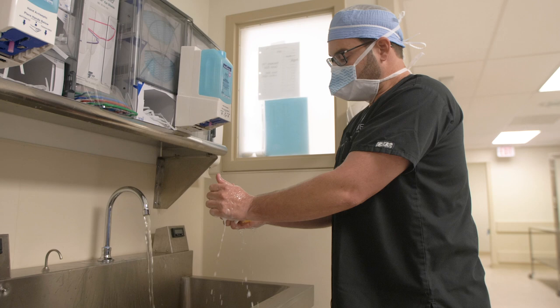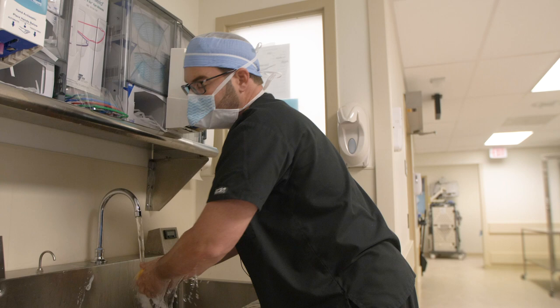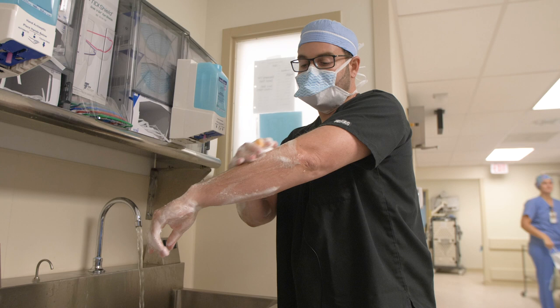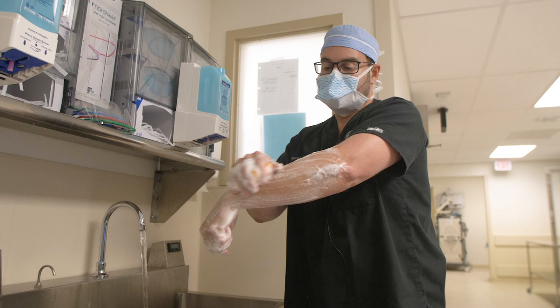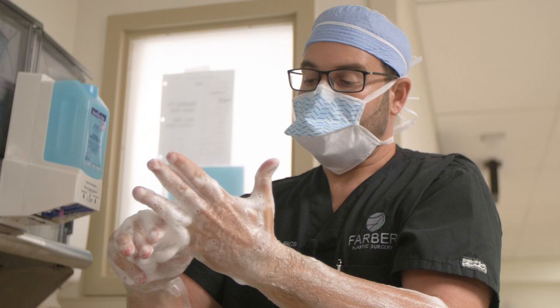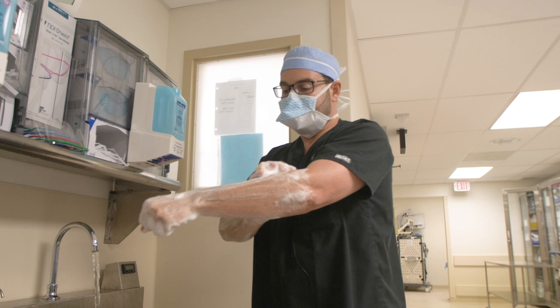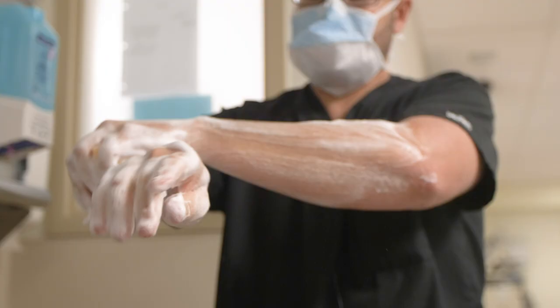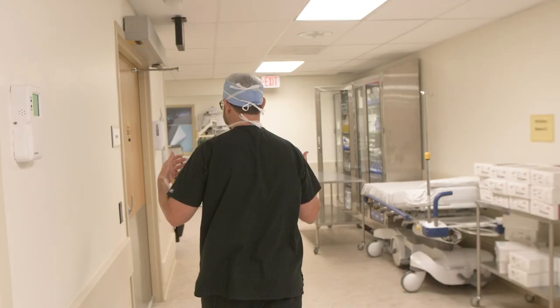We're about to start our operation. Alexa's really excited and we're really excited for her because she works really hard, she diets, she exercises, and she feels like her body is not in proportion — her top half doesn't match the bottom half. She really wants improvement when she wears clothing, bathing suits, and tighter clothes, so we're really happy for her. This is where we scrub, and this is my time to get zen and focused — I really like this time to think about the case and get ready for surgery.